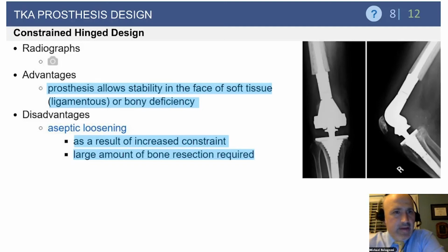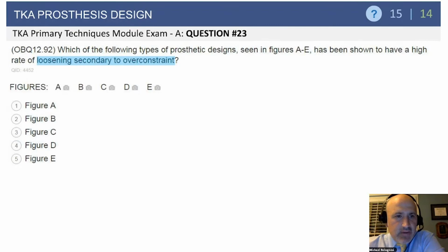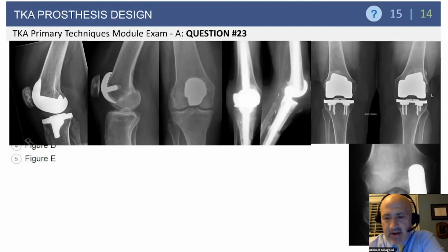The advantage is it can provide the highest level of stability in the face of bony and soft tissue loss, particularly ligamentous loss, medial collateral ligaments. Disadvantages, again, comes up: aseptic loosening. Again, increased constraint means increased stress to the cement implant bone interface, and you've got to take out a lot of bone to get these implants into position.